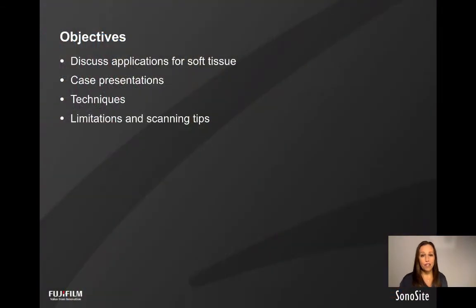Our objectives for this webinar: I'll give you a brief overview and discuss the applications for soft tissue. We'll go through case presentations for each of these applications. We'll describe the techniques for each of these applications, and within each application, the limitations and scanning tips.